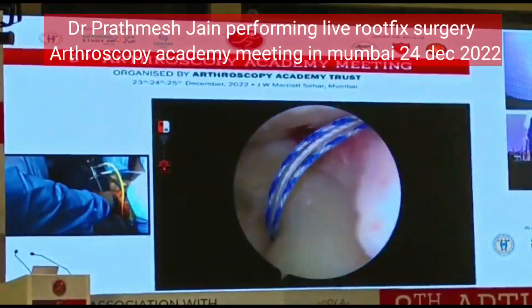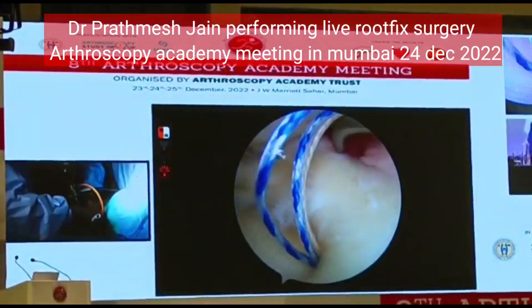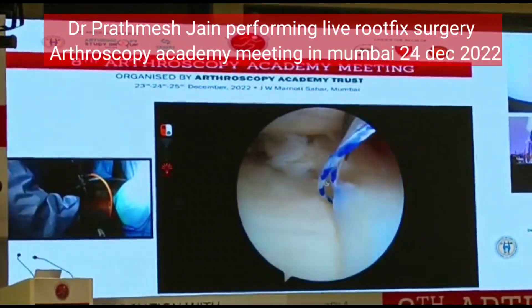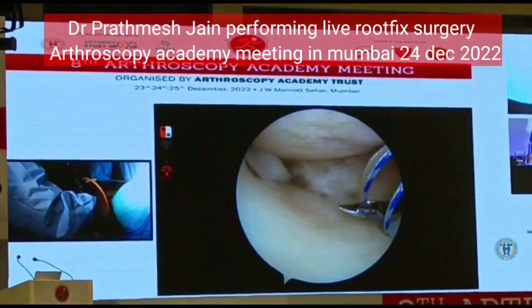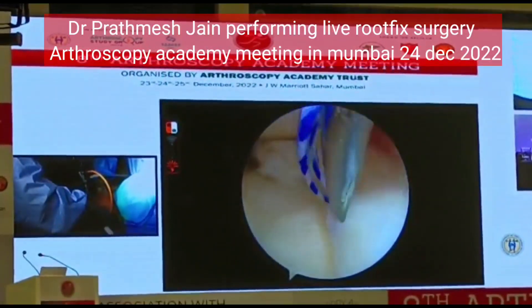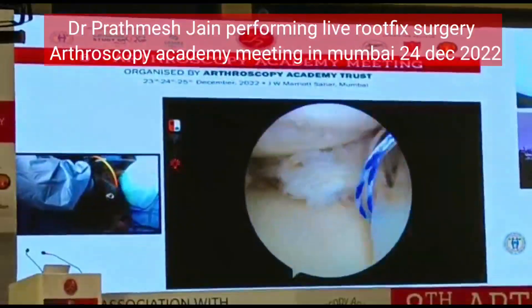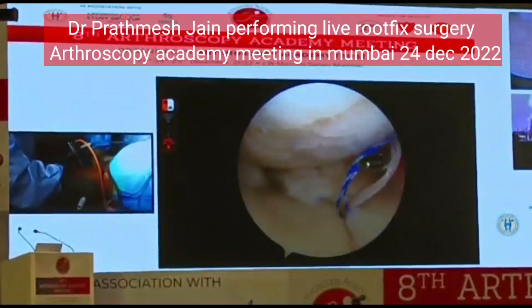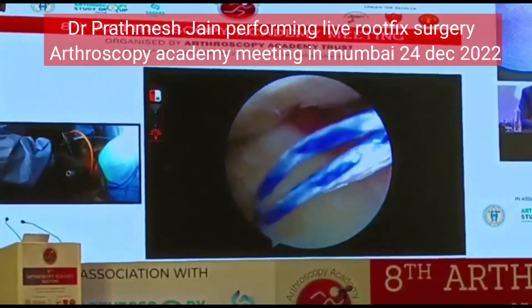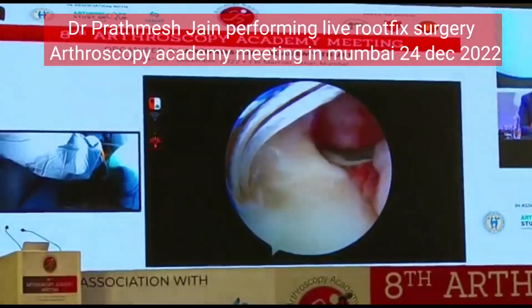Pratham, he is talking about the quality of the meniscus — not that good. So that is why we are planning to improve. If you see here, this is the area of the tibia that will be exposed. In these particular cases, the meniscus usually extrudes out in this fashion, and that is why there is overloading and degeneration on the femur as well as the tibia. This part of the meniscus is actually involved.